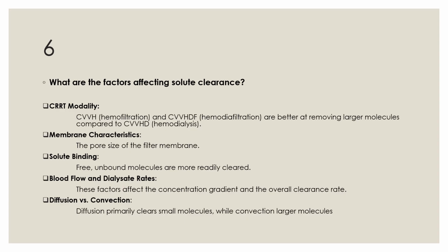What are the factors affecting solute clearance? It includes CRRT modality. CVVH and CVVHDF are better at removing larger molecules compared to CVVHD. Membrane characteristics. The pore size of the filter membrane directly affects the size of molecule that can pass through it. Solute binding.